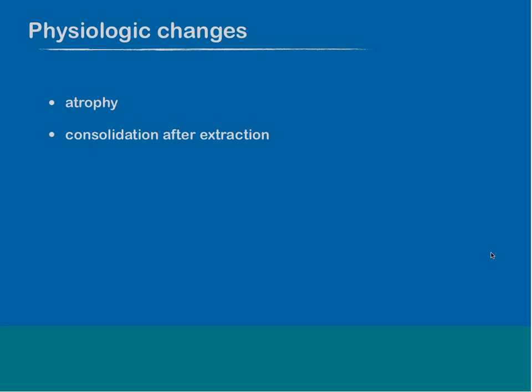So please remember that if a consolidation is retarded or prolonged, if there is no real consolidation in an alveole or a root socket, you have to think of any kind of metabolic problems or other issues, maybe an inflammation which is leading to some kind of retardation of this consolidation. So please check for extraction sockets, if there is a real new bone pattern.